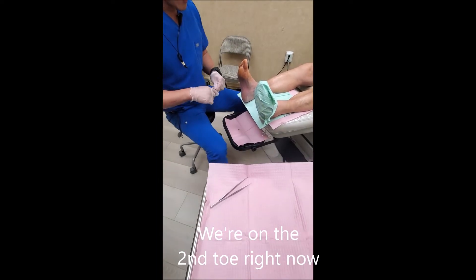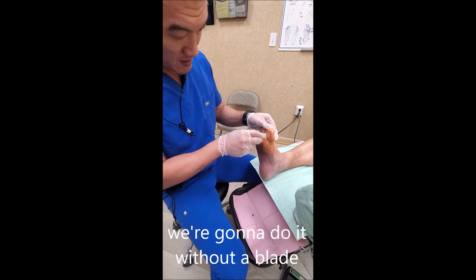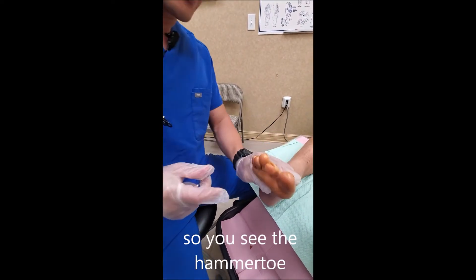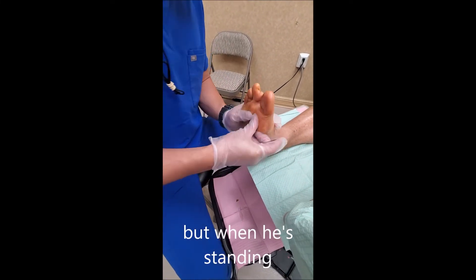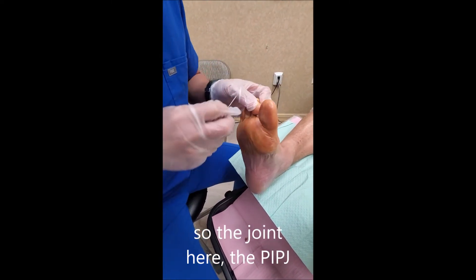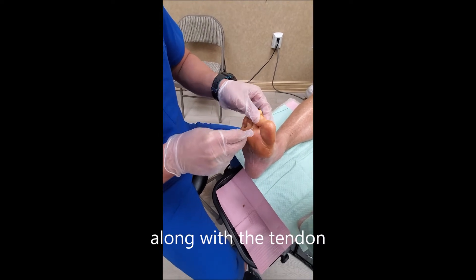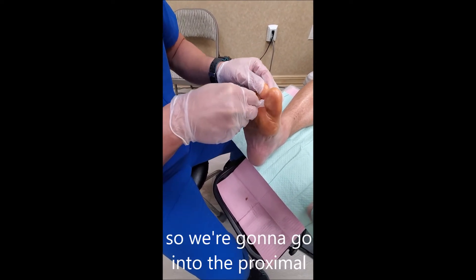We're going to work on the second toe right now, and we're going to do it without a blade — we're going to go ahead and release. You can see the hammer toe; it's reducible, so it's soft, but when he's standing it becomes nicely rigid. The joint here, the PIPJ, is contracted along with the tendon. This is the distal interphalangeal joint, this is the proximal interphalangeal joint, and we're going to go into the proximal.